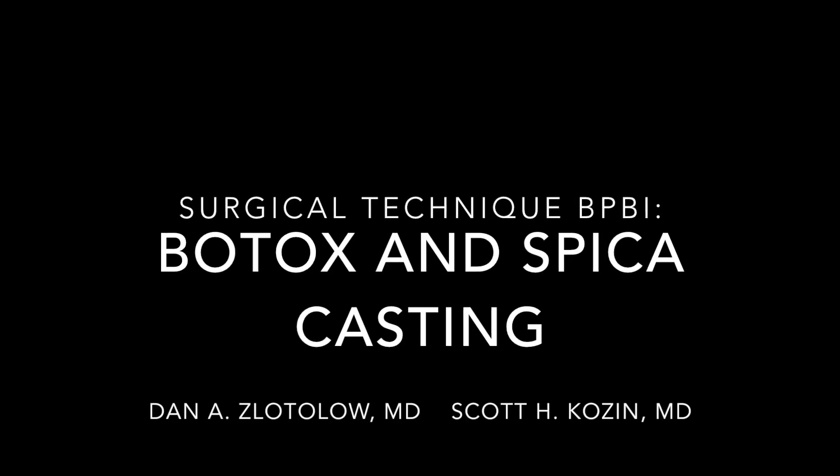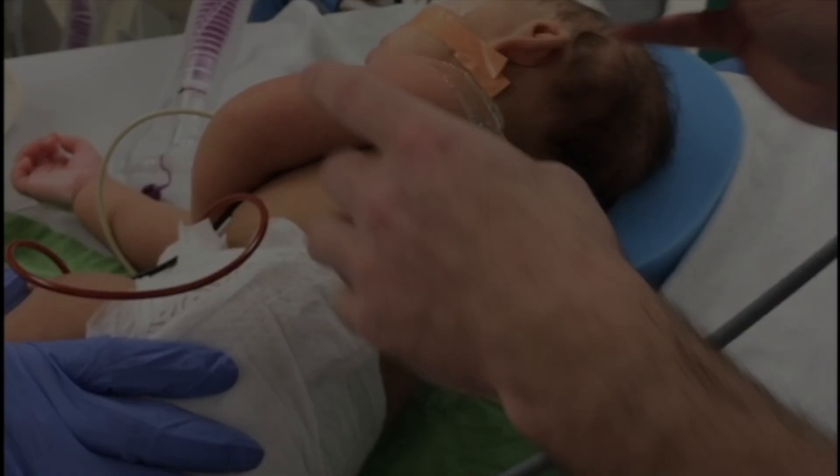This video will demonstrate Botox and spica casting for a child with a brachial plexus birth injury.